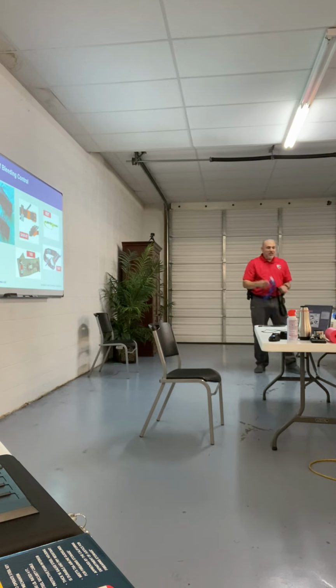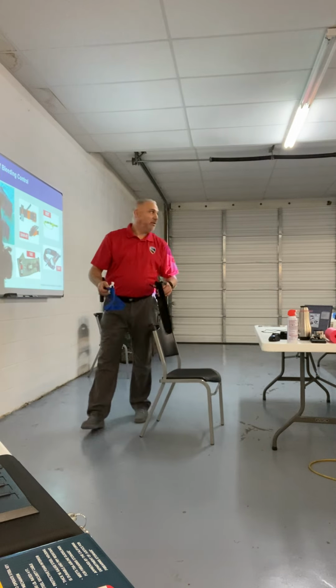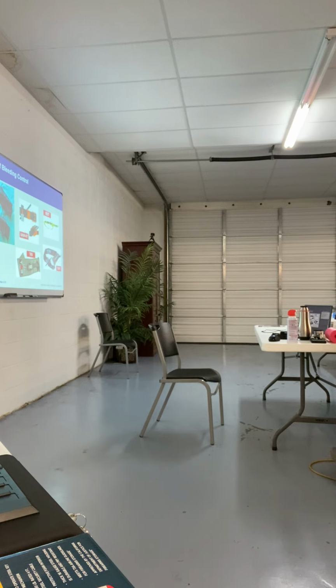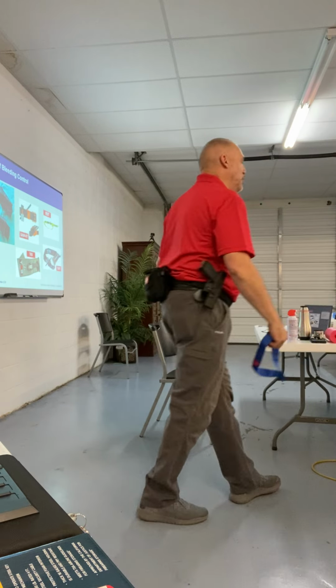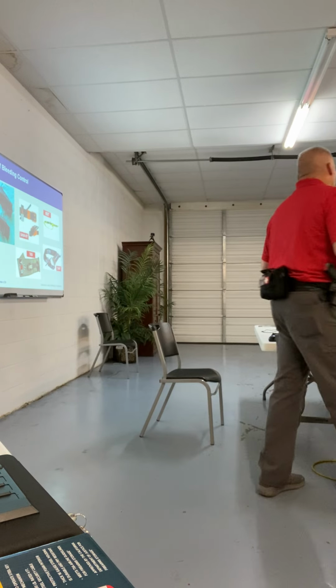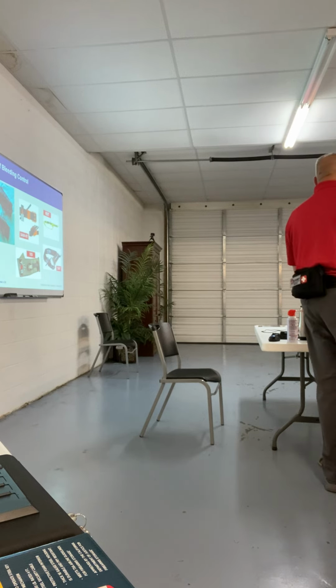I use these to train, and every class falls into the same thing. Like, oh my God, how can I break this thing? And then I say, try to break this one. When you finish, give it to that big brute in the back and let her break it. You see the difference? There is now a different type of plastic out. There are six different companies in China right now doing knockoffs of the CAT 7.